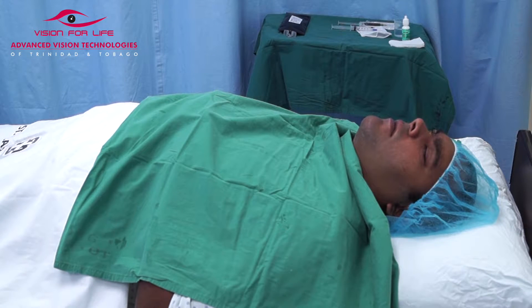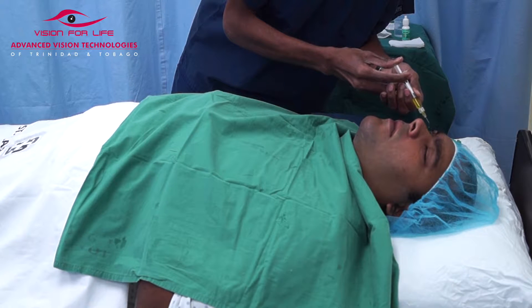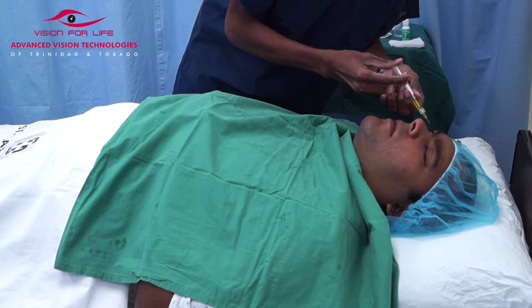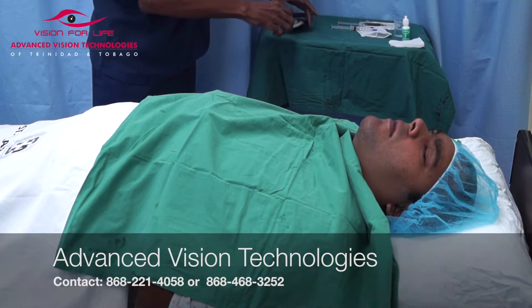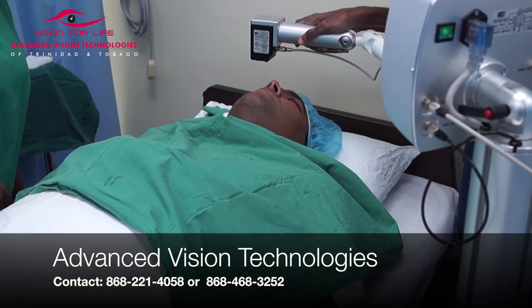What this method involves is putting some anesthetic drops into the eyes, having a little speculum to keep the eye open so we can get access to the eye, and using riboflavin — which is vitamin B2 — on the eye in the form of eye drops at regular intervals.